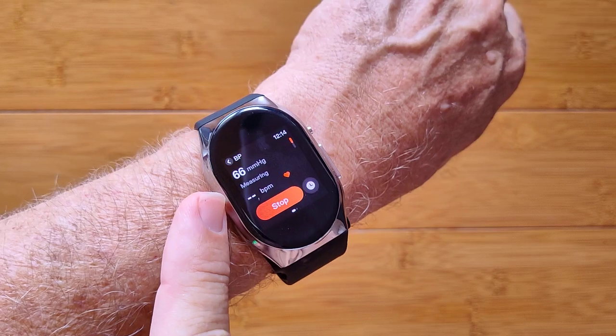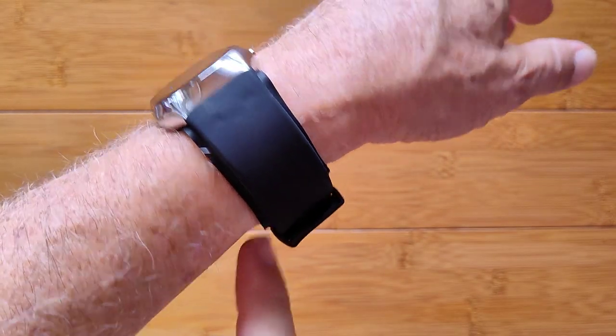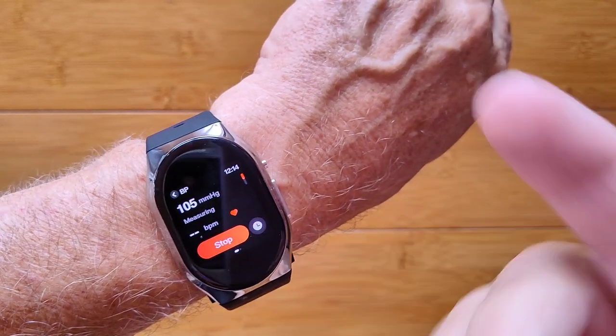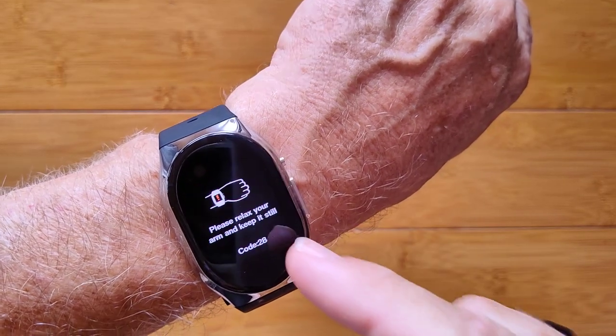It's going to fill that bladder with air, tighten it around your wrist, and actually use a microphone inside to determine your systolic and diastolic blood pressure and give you a reading on the watch.